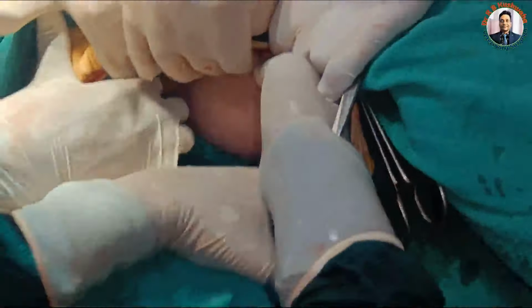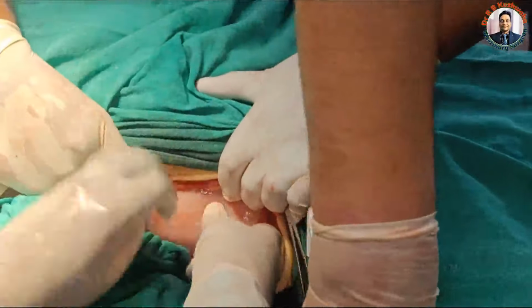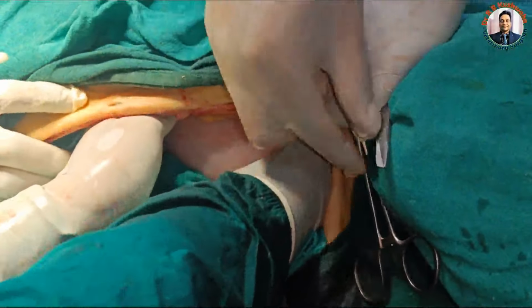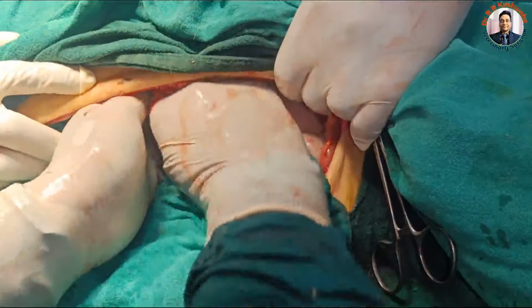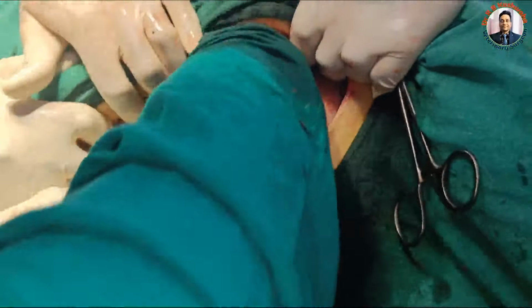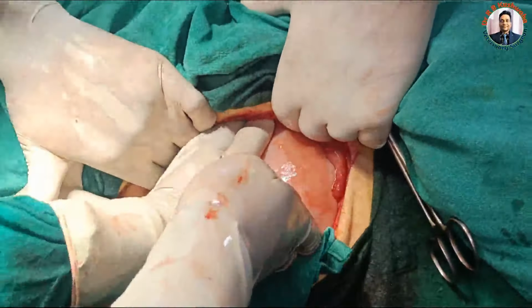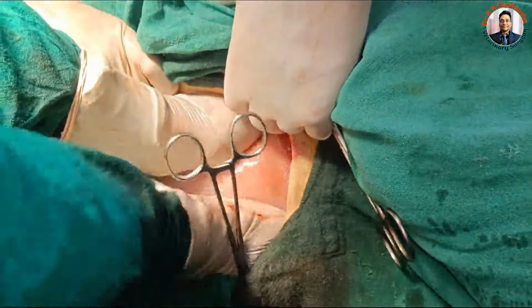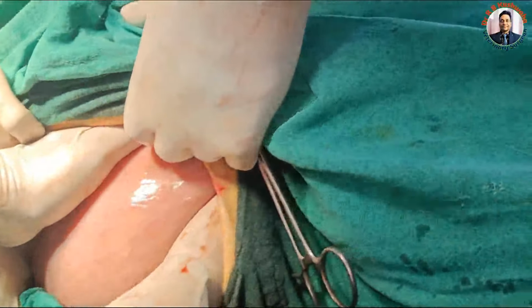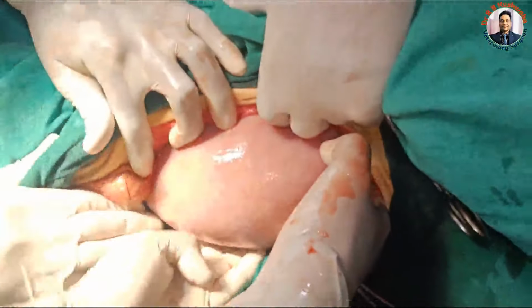This is the third drape we are putting inside the cavity. Now you could see this is the greater curvature of the uterus. Towards my right side, this one is the ovarian end. I still try to stretch it, but because the size is very small, even this much is sufficient. Give me the blade.